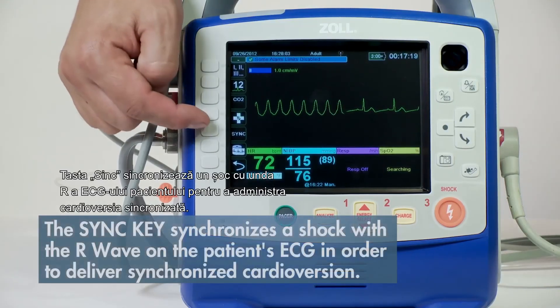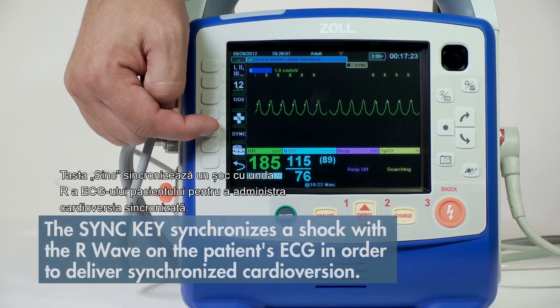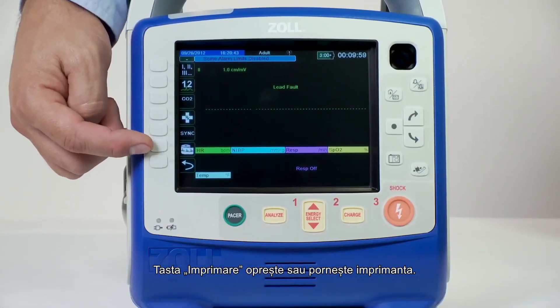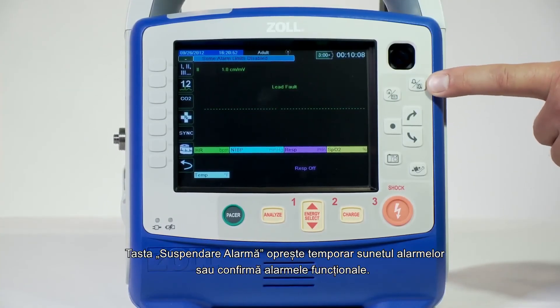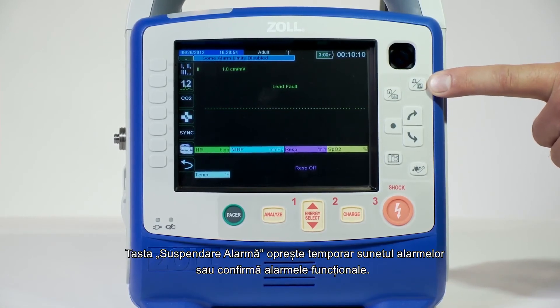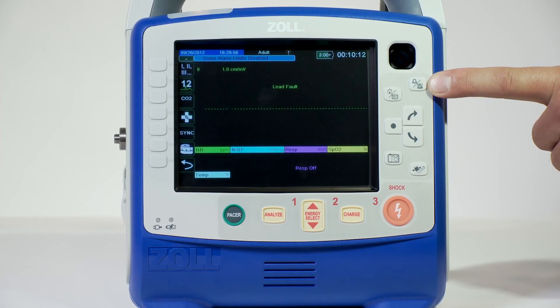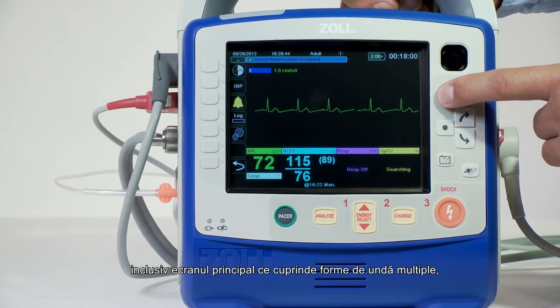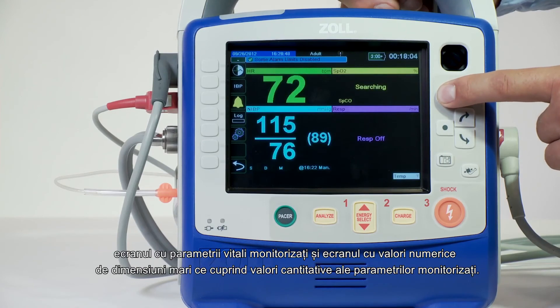The sync key synchronizes a shock with the R-wave on the patient's ECG in order to deliver synchronized cardioversion. The printer or recorder key either stops or starts the printer. The alarm suspend key temporarily silences alarms or acknowledges functional alarms — examples are ECG lead off or pulse ox cable off. The home button toggles through three screens, including the multi-channel home screen, vital trends screen, and a large numeric screen with quantitative values.